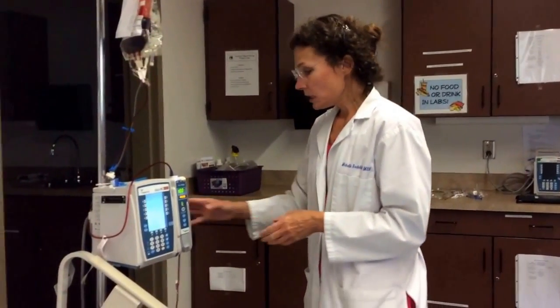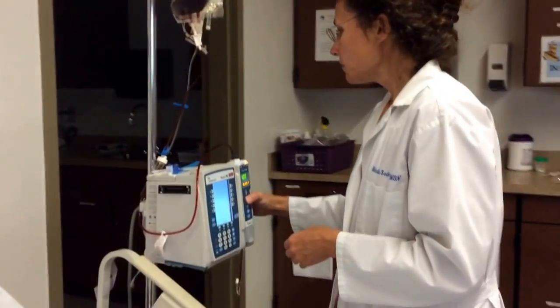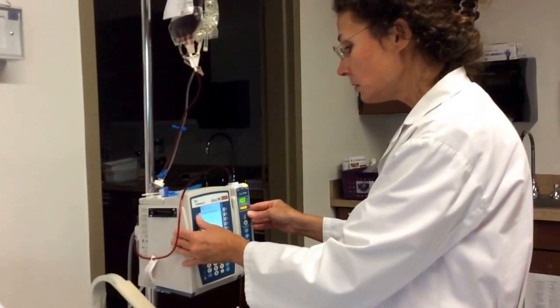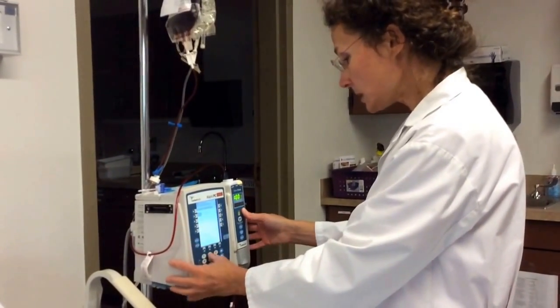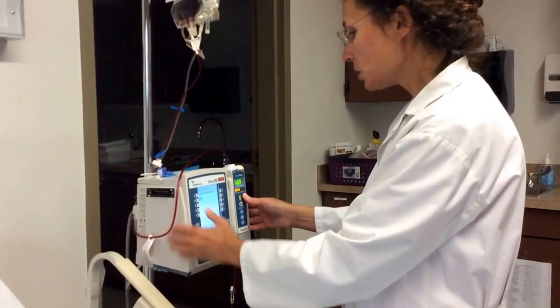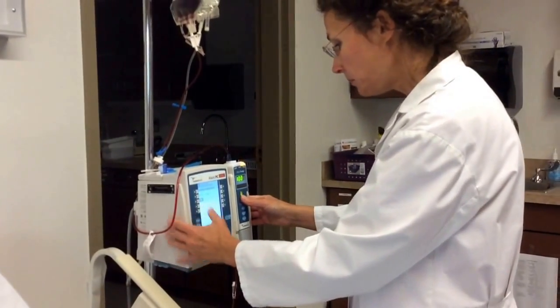So I am going to increase the rate of his blood transfusion at this time. I'm going to set my rate at 200, and I'm going to put the volume remaining in.